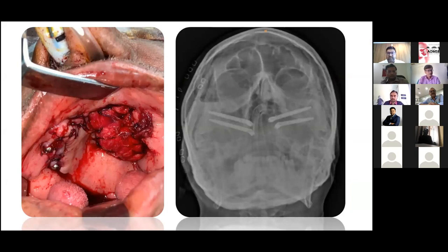As we did not have the privilege to go for a free flap on the patient's side, we had to use some kind of local flap to close the defect. So we have used the temporalis flap in this case. Again, we might have to go for debulking in the post-op phase when we start the prosthetic part. As you can see, the multi-units on the left side, where we have done the temporalis, have been completely embedded within the flap right now.